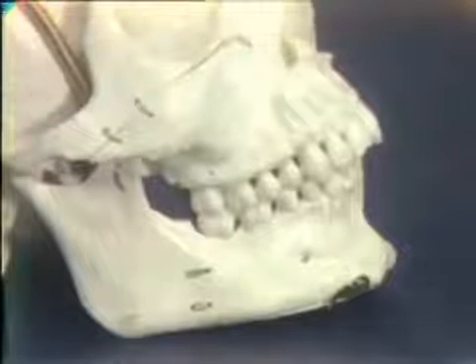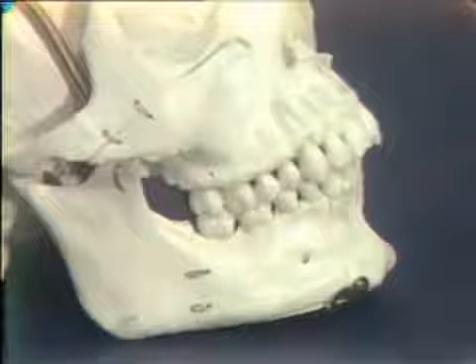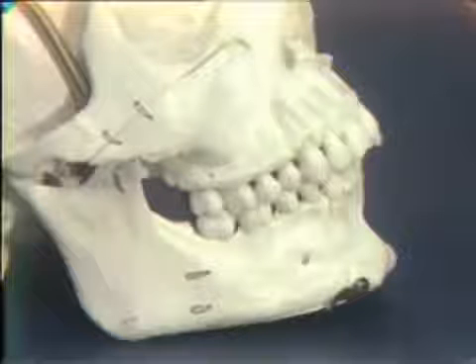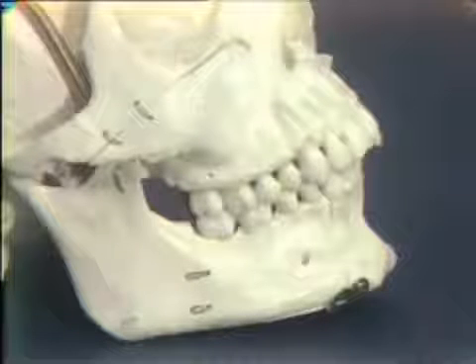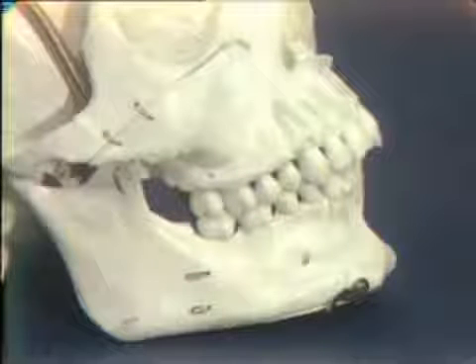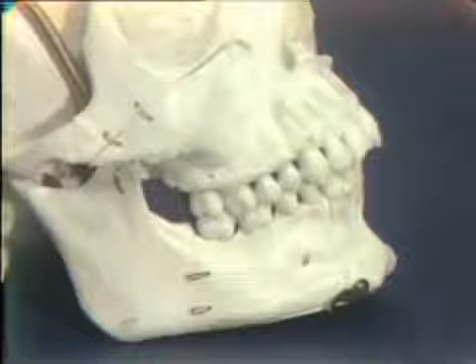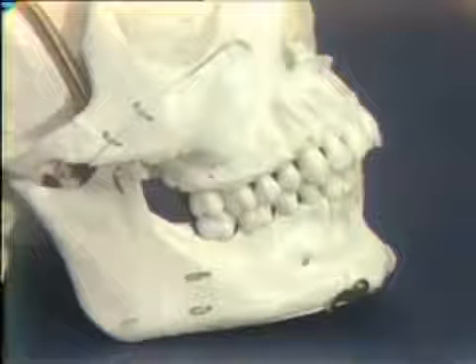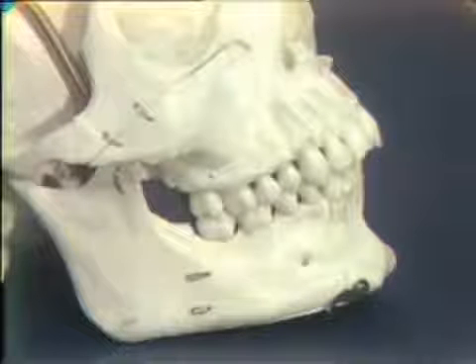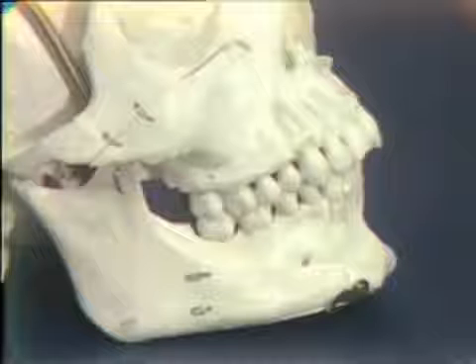All right, we'll demonstrate buccal infiltration of the maxillary first molar. And let's recall, in so doing, that we'll be anesthetizing both the terminal branches of the posterior superior alveolar nerve and the middle superior alveolar nerve, which anesthetizes the mesiobuccal root of the first molar. And this anesthetizes first molar and adjacent bone and overlying alveolar soft tissues.